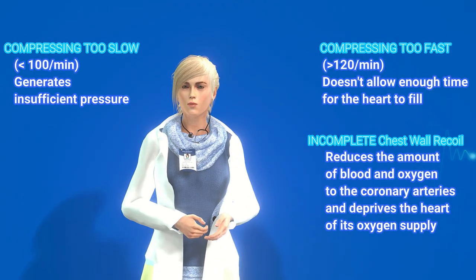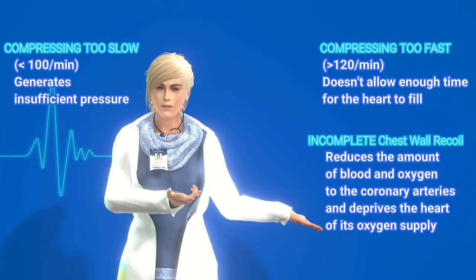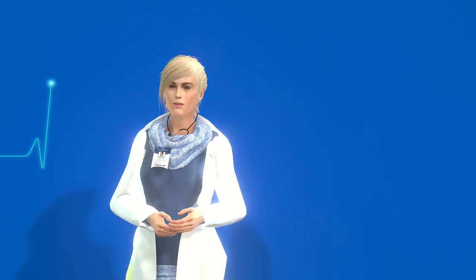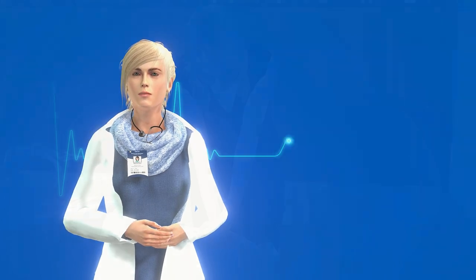It is essential to make sure you compress at least 2 inches, allow for full chest recoil, and compress at least 100 to 120 times a minute. You do not need to perform mouth-to-mouth breathing for an adult or teen victim. Hands-only CPR and the use of an AED will significantly improve the survival rate for the victim.